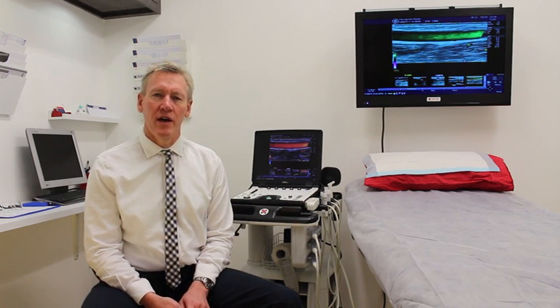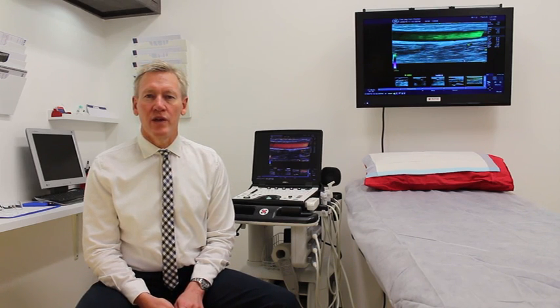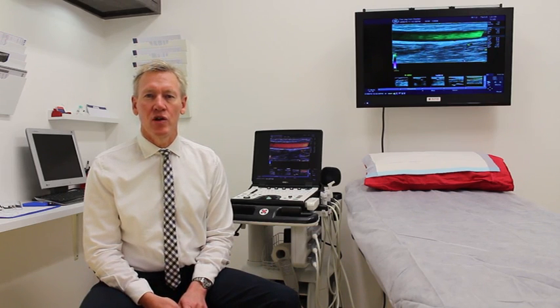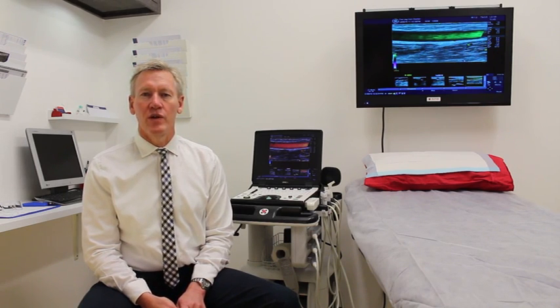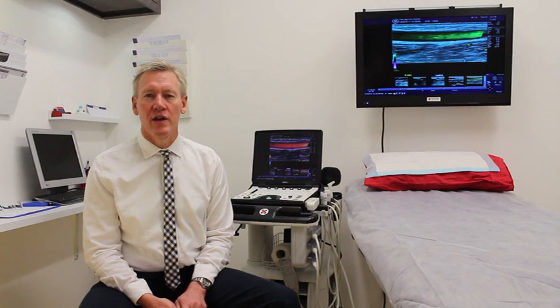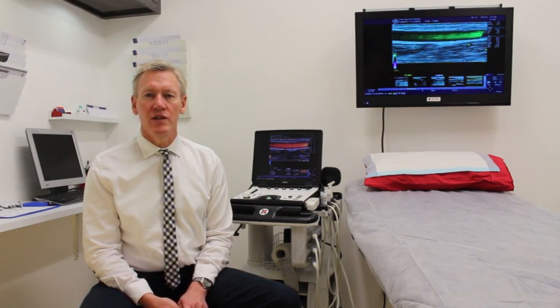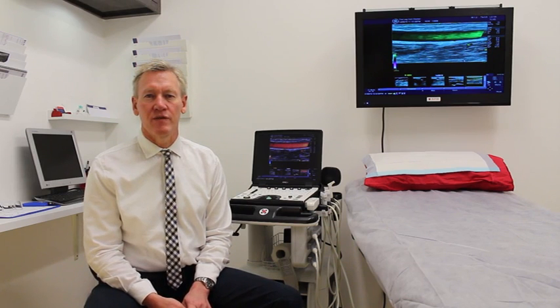So the ultrasound allows us to see these veins and to treat them. We use endothermal ablation to treat incompetent saphenous veins. We use ultrasound-guided sclerotherapy normally to treat incompetent tributaries distally further down the leg. Once we've used the ultrasound to treat these veins with either endothermal ablation or ultrasound-guided sclerotherapy, we then need to establish whether or not we've been successful in occluding these veins.